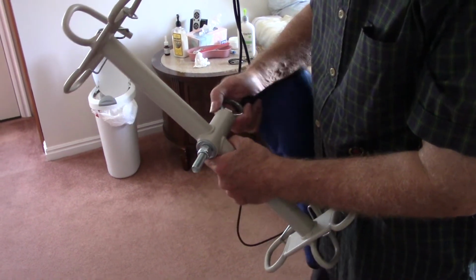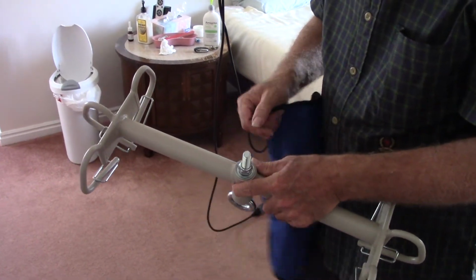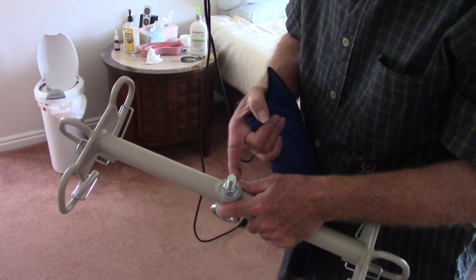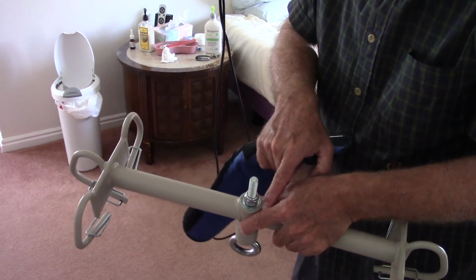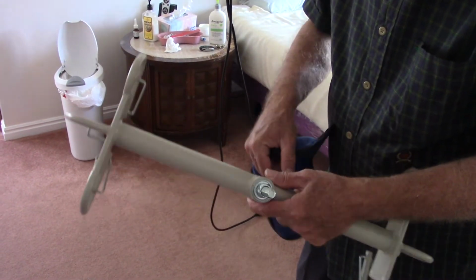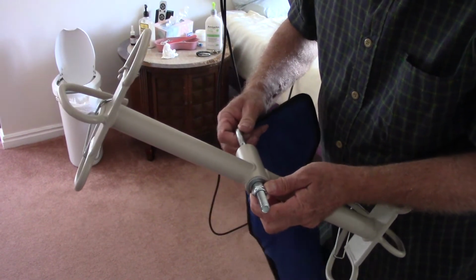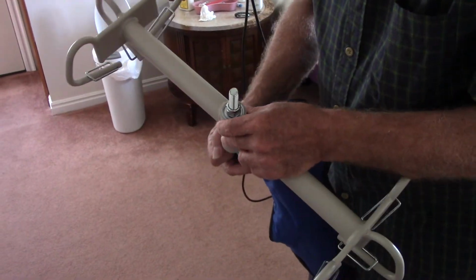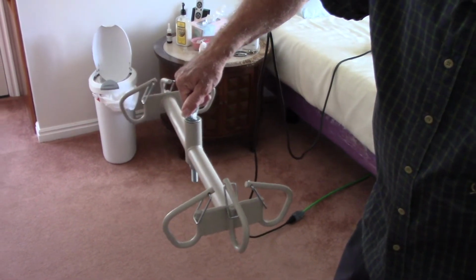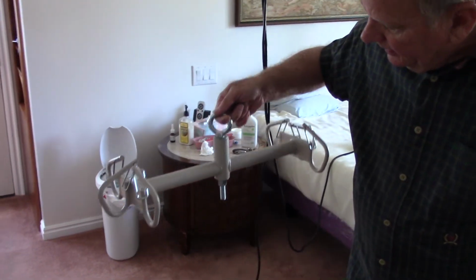I had a friend, he's actually my tax advisor, and he says, oh, I know how to handle that. We went down to Ace, and they have a little ball bearing wheel. And the ball bearing wheel is made so that one side is slightly smaller than the other side. It fits down in there and then catches on this lip. The other side's smaller, so it fits down in the hole. Then we just got a big eye bolt, and we got a lock nut on it, and put it down through. So it's made exactly to do that. And it worked really well. Ace has them, Home Depot, Lowe's didn't have them. And they're all in the parts list, so you can see exactly what they are. But it worked very well.